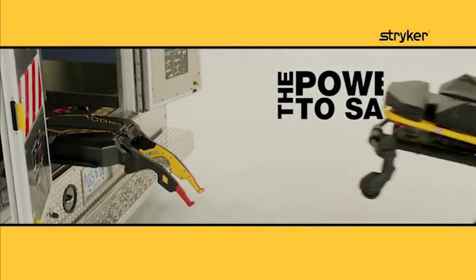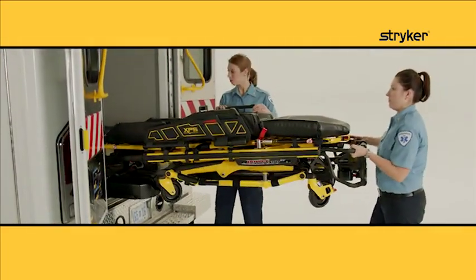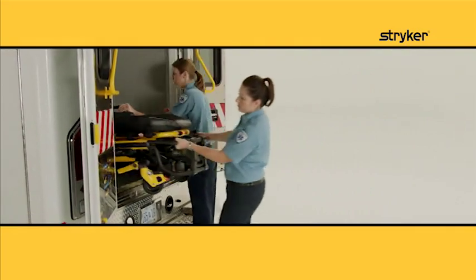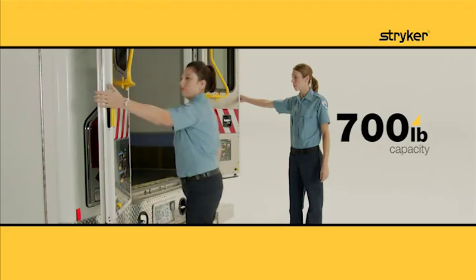The Power Load system allows operators of almost any size to load and unload the cot and a patient up to 700 pounds with less spinal load, reducing the risk of injury.